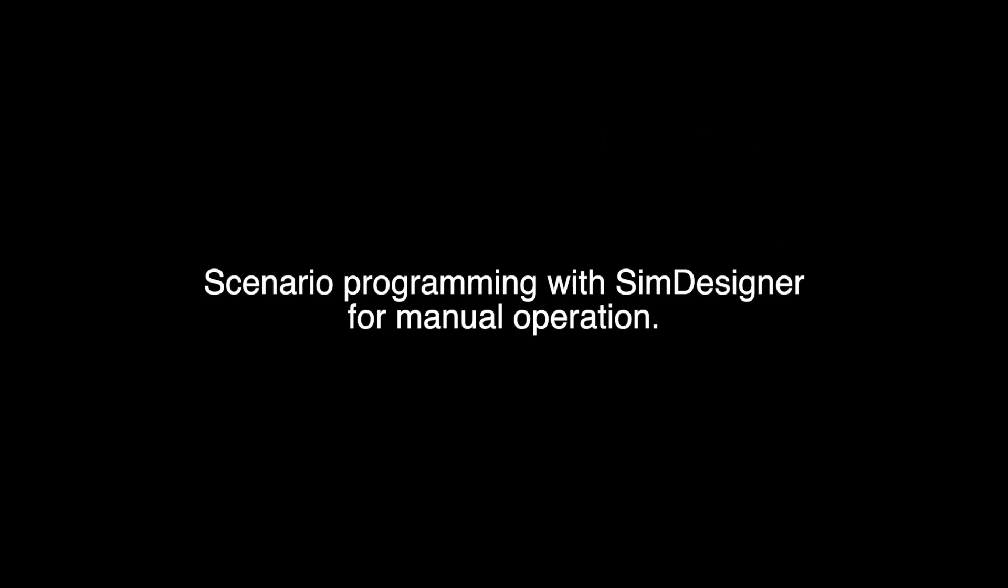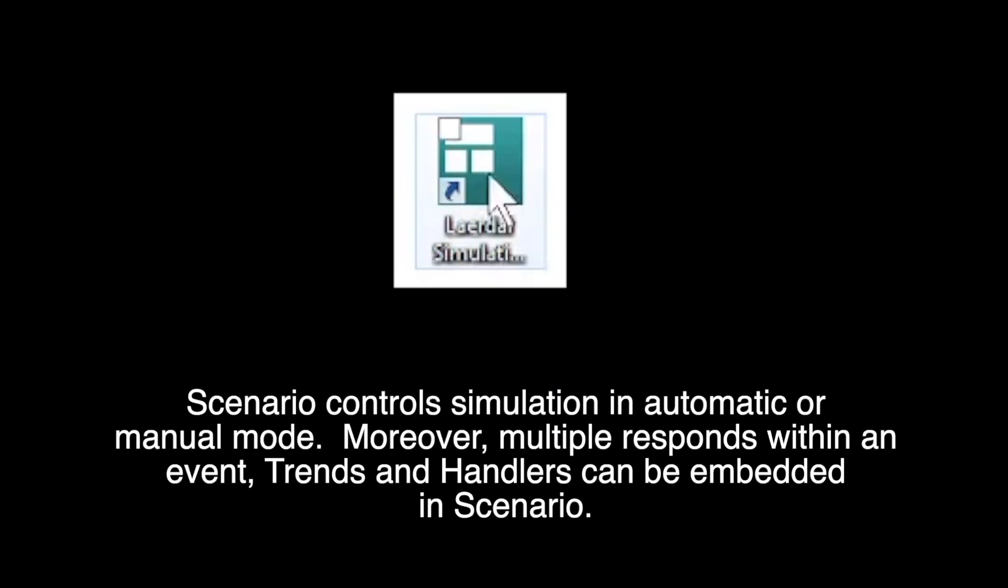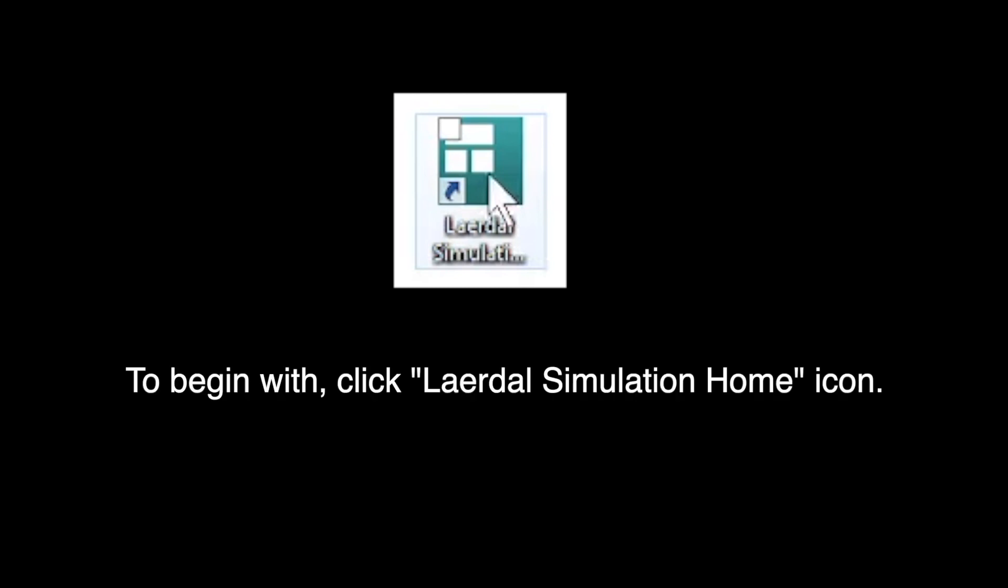Scenario Programming with Sim Designer for Manual Operations. Scenario controls simulation in automatic or manual mode. Moreover, multiple responses within an event, trend, and handlers can be embedded in scenario.